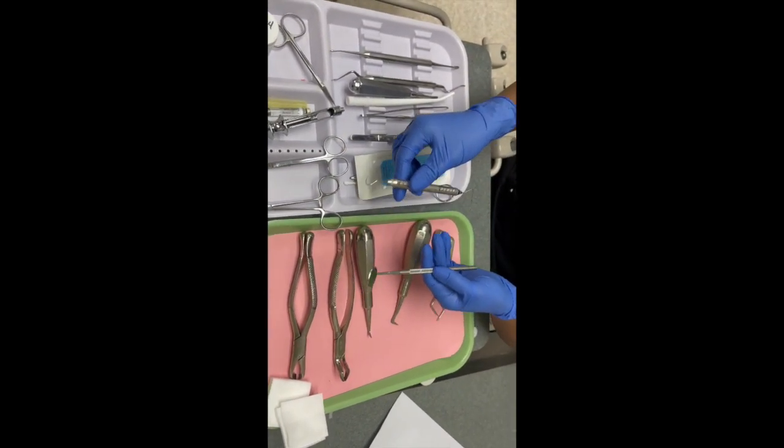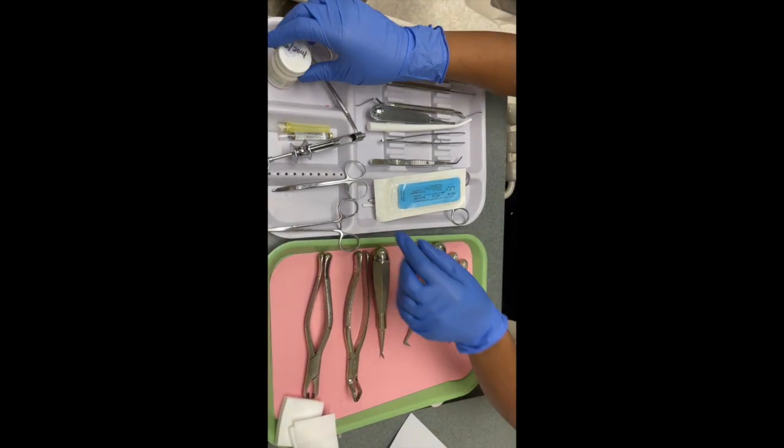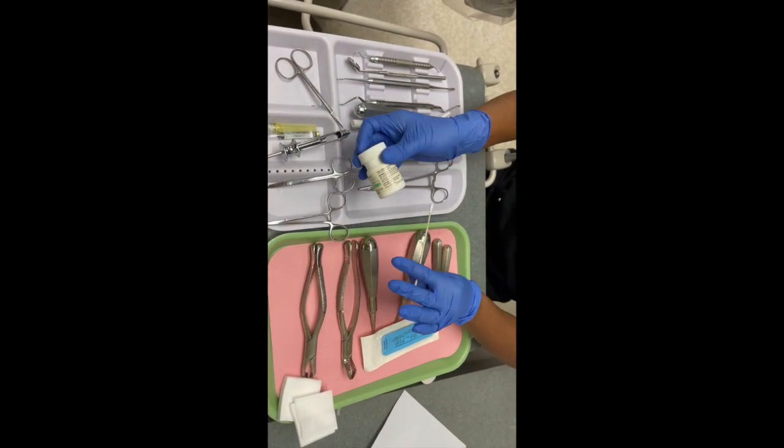First you have a mirror and an explorer to examine for teeth decay — the mirror is for indirect vision. Next you have your topical anesthetic and your cotton applicator, which you just apply the topical with.